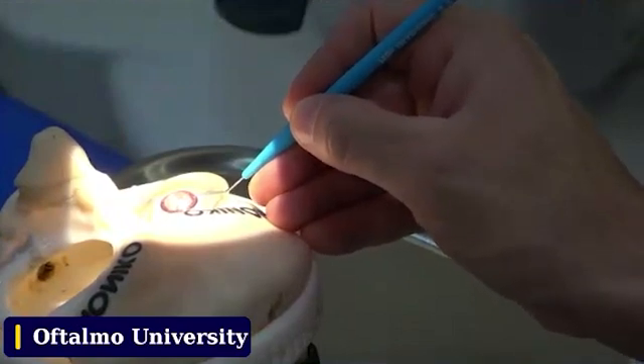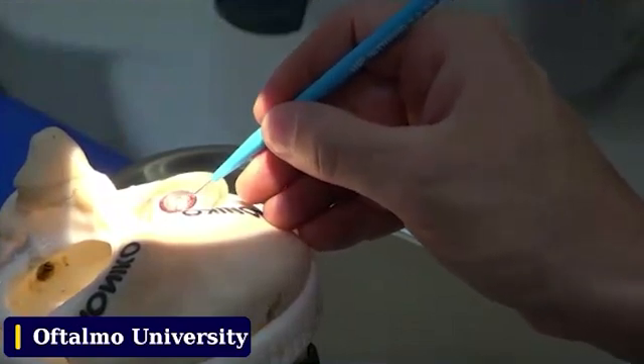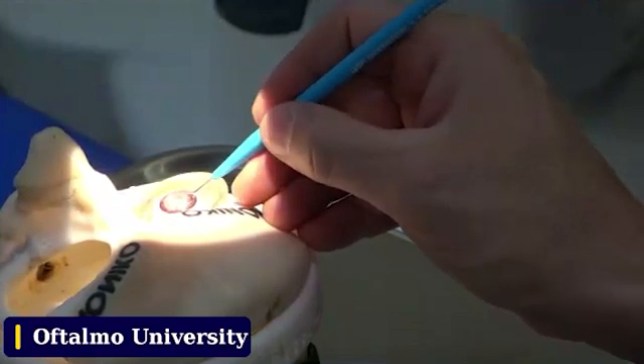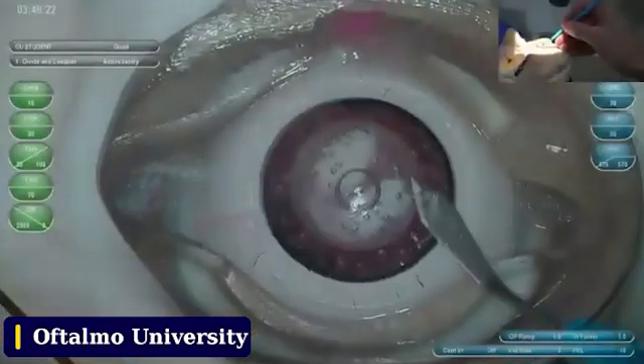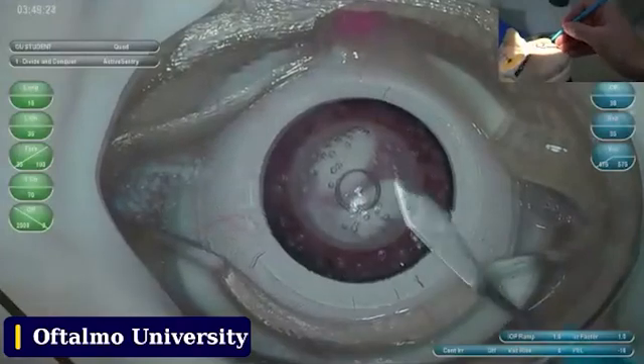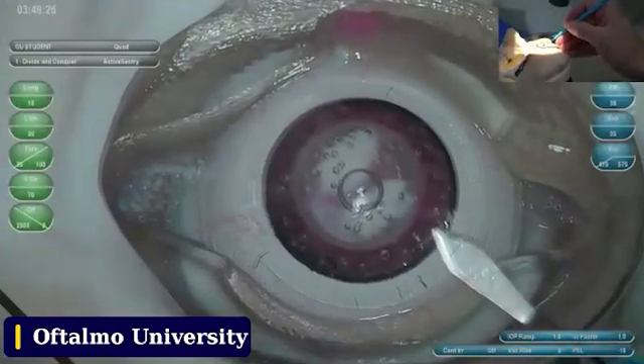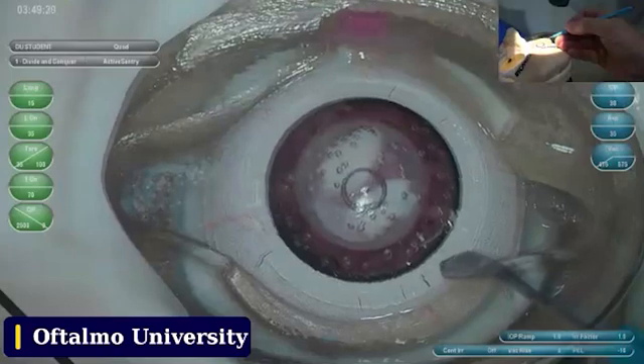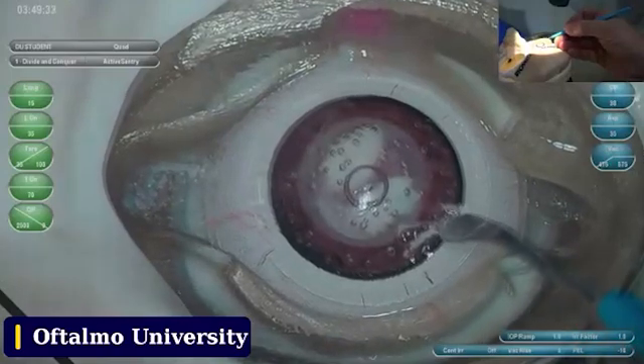Aim to the center of the eye, and be very aware that the movement goes in and goes out in the same way — you don't want to overcharge the size of the incision. I like to have this first plane right here.